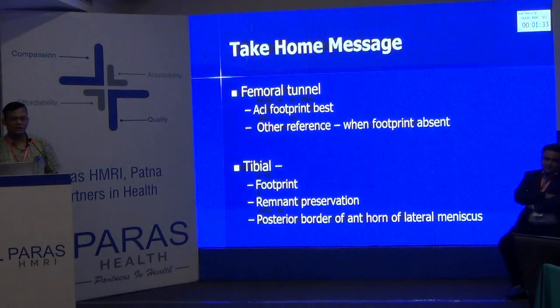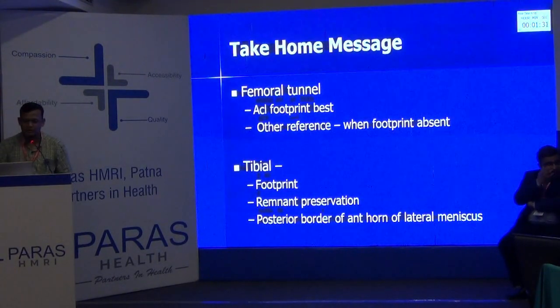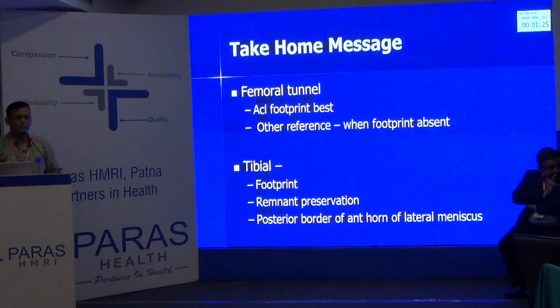for an ideal ACL reconstruction, the femoral footprint should be the best if you can reproduce it, with other references like the 2 millimeter wall, leaving 2 millimeter of wall and drilling with the offset jig. And for the tibial footprint, you also try to preserve the footprint as much as possible. Remnant should be preserved for better preparation, and the posterior border of the anterior horn is probably one of the best methods for reference for the tibial side.